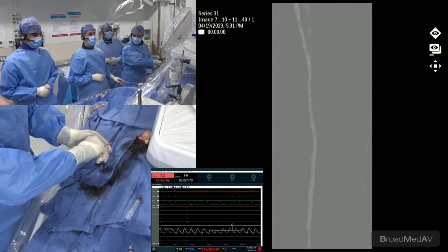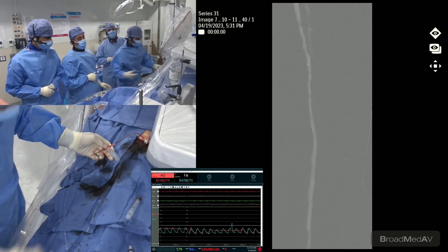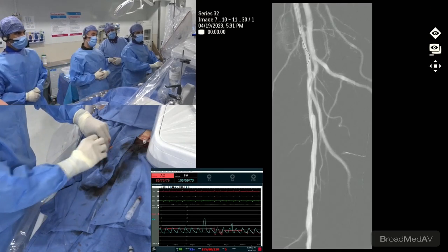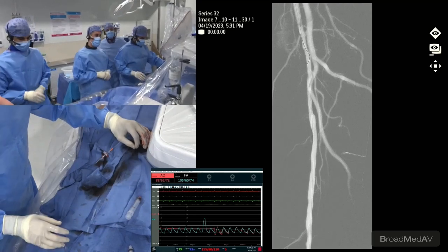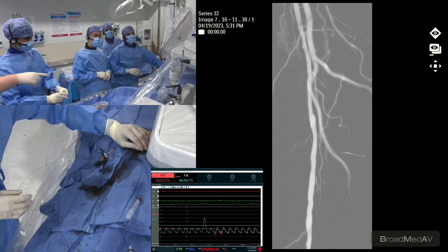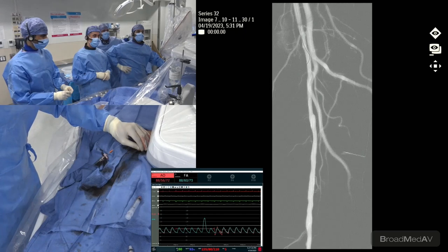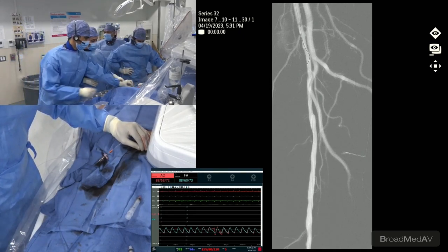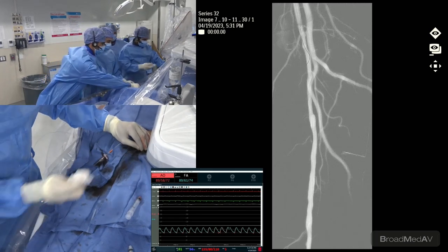So Ramin, maybe for those at home, this is the area of that diffuse tubular lesion, whether you want to fix it or not. At this area, it was about a 5 millimeter gradient, Vishal, right? Yeah, 5 to 7 millimeter gradient. So Ramin, question: can you talk to them a little about restenosis rates based on lesion length and stent used, balloon used?